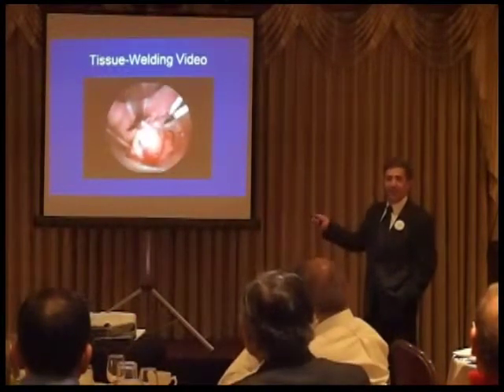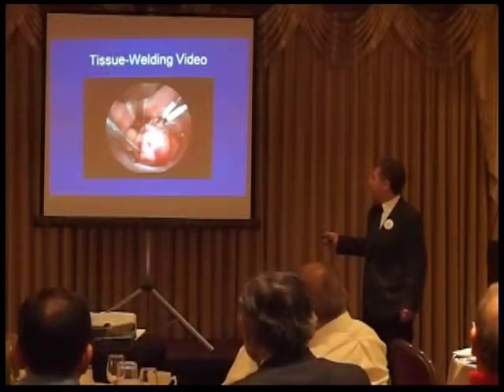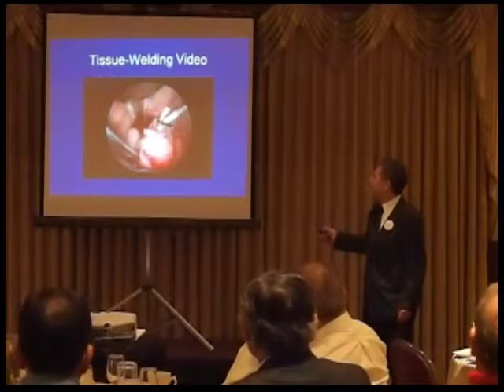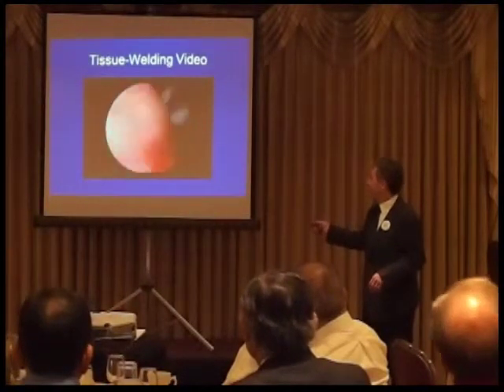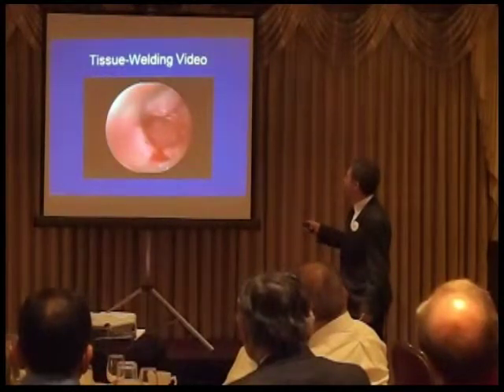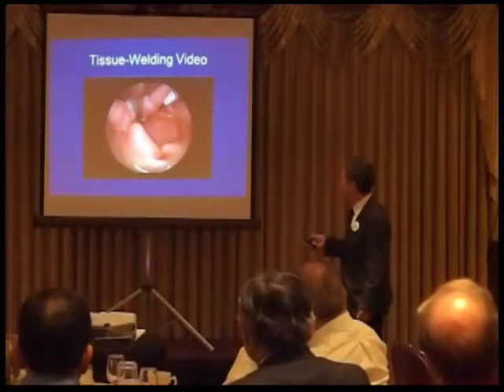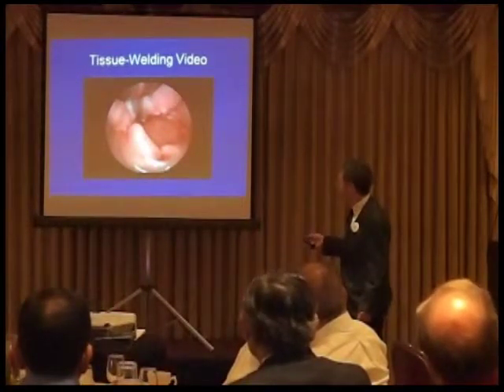This was almost like a useless demonstration, except for when he's done here. The thing that sort of inspired me was, I mean, this was a trivial tonsillectomy, but I wish I could pause this, there's almost no raw area there. He preserved the whole anterior pillar. He preserved the whole posterior pillar.